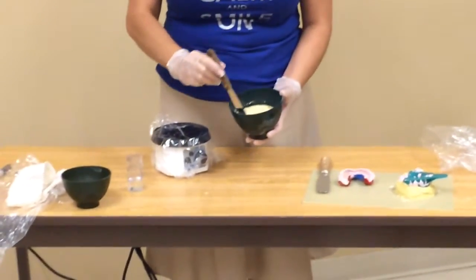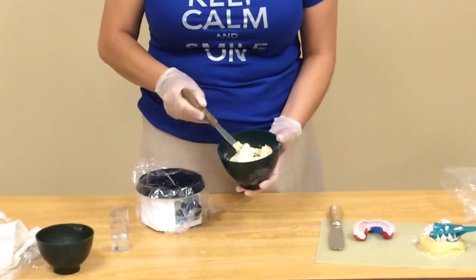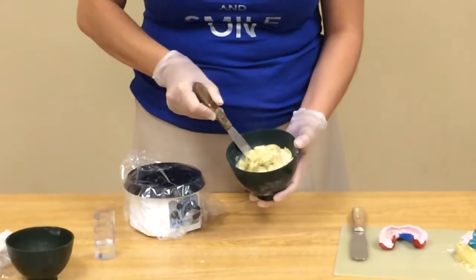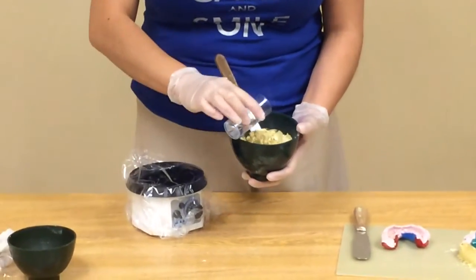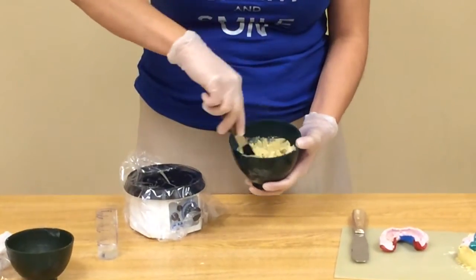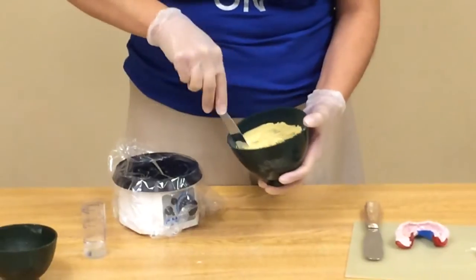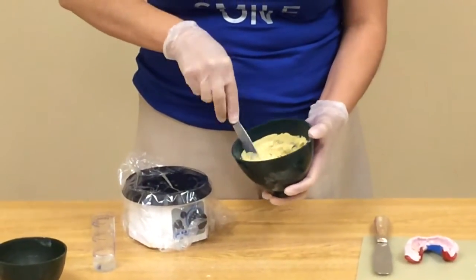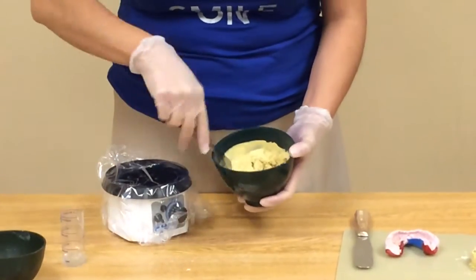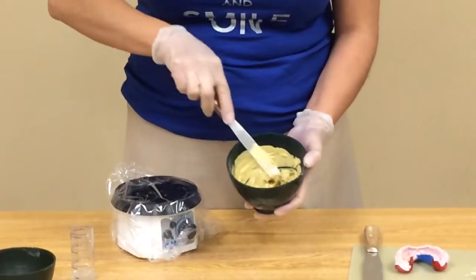You don't want to mix too much because the more you mix, the more bubbles that will get into the mix. So we're just going to slowly incorporate. When you finish mixing this, it should be a consistency like peanut butter — nice and creamy peanut butter.